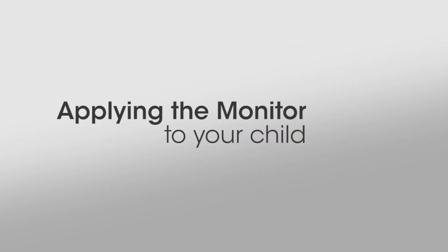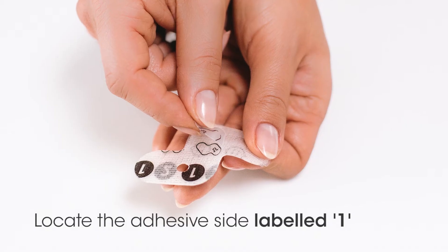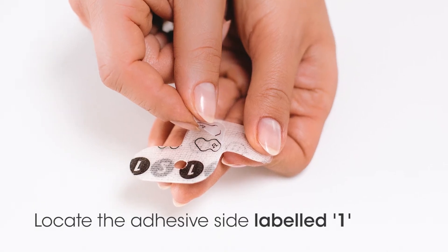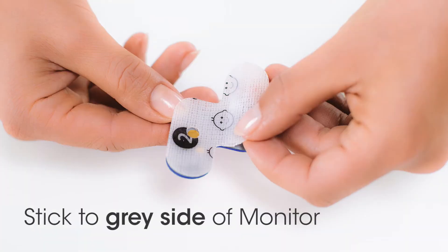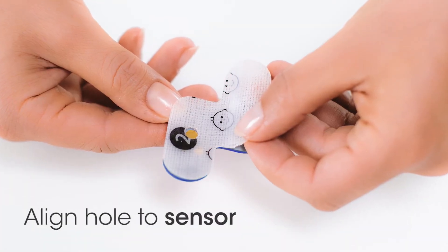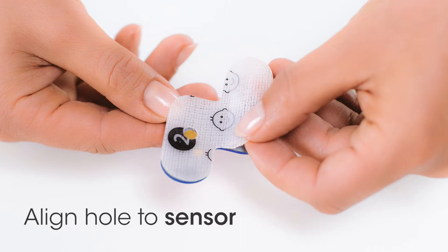Applying the FeverSense Monitor to your child. First, locate the side of the adhesive patch labeled 1. Remove both pieces of the backing and stick it to the gray side of the monitor. Make sure the hole is aligned to the metal sensor.